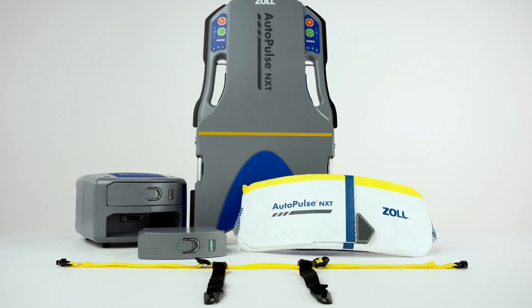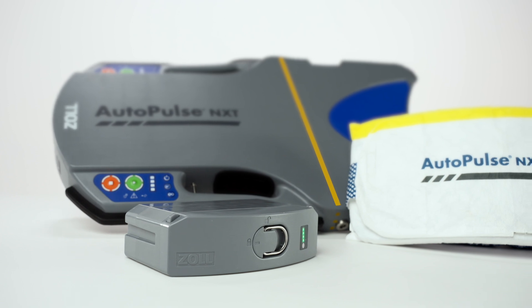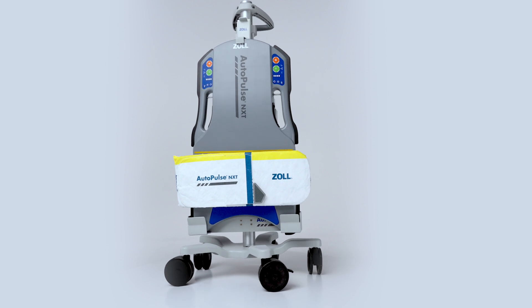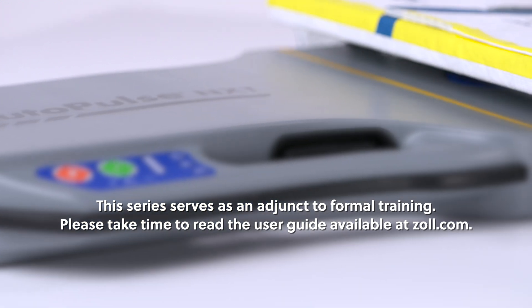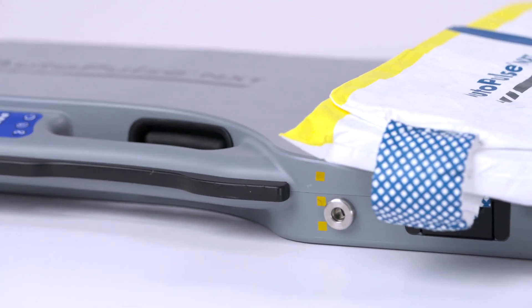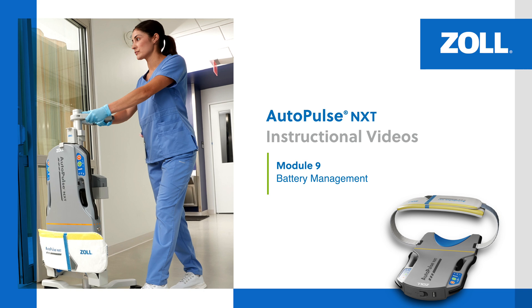Welcome to the AutoPulse NXT Resuscitation System in-service video series. This multi-part series provides detailed information about the AutoPulse NXT Mechanical CPR device and its functionality. This series serves as an adjunct to formal training. Please take time to read the user guide available at zoll.com. Proper use of the system requires a thorough understanding of the product, appropriate training, and practice. In this module, we review battery management for optimizing the use of the AutoPulse NXT Resuscitation System.